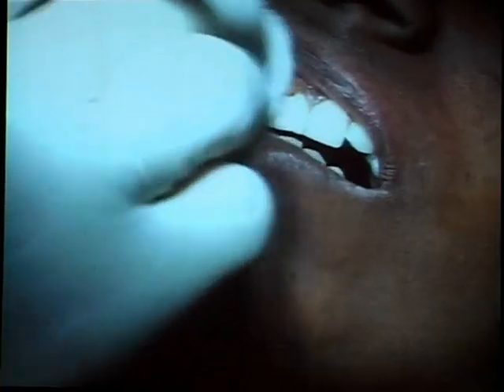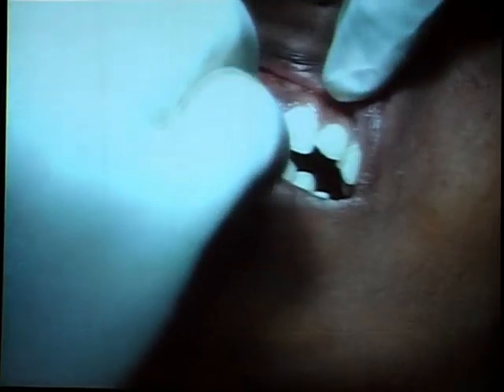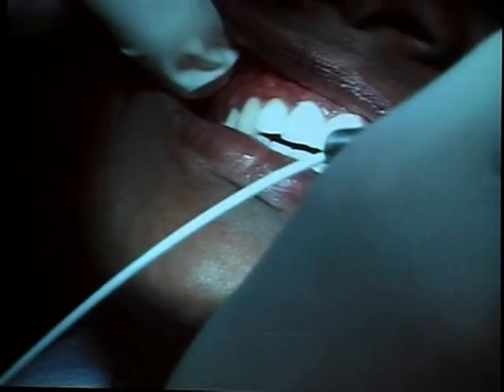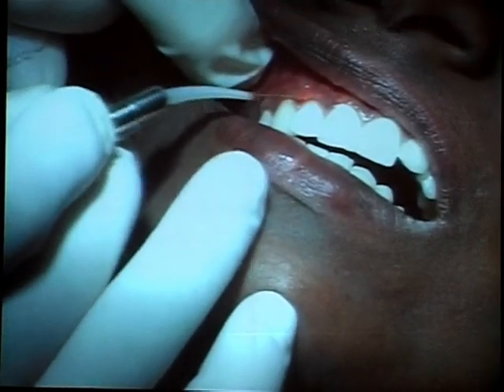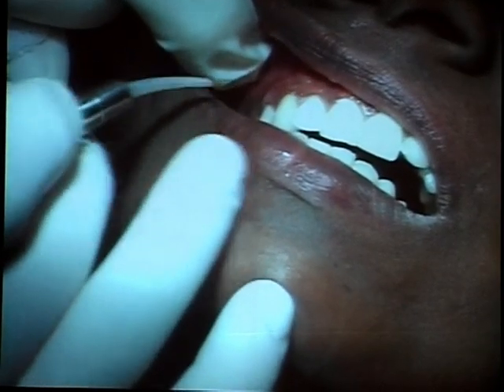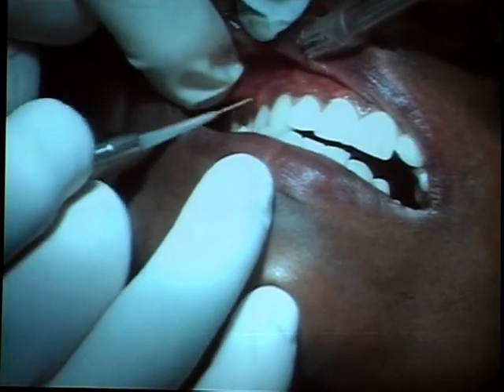I would like to say that when we are doing this, of course we do it on patients where there's a lot of gingival display. When we are using this, there are maybe two factors which I found. One is to be careful not to nick the marginal gingiva, because you can just lose it for good. This is a very important point. Secondly, I found that the most difficult part, where we encounter the maximum pigmentation that is very difficult to remove, is in the interdental part. The interdental papilla has a very deep level, a lot of melanin there.